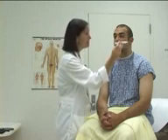The next step are the pupillary reactions. This requires you to use your pen light again and to have your patient look straight ahead at something, pick a spot on the wall, and then you will elicit the direct pupillary response so that you're watching the eye that you're shining the light on, and then look in the opposite eye for the consensual response. Same thing on the other side, direct and consensual.